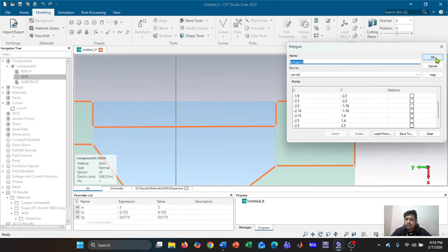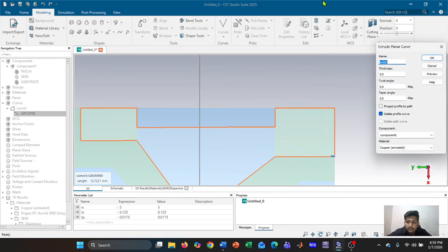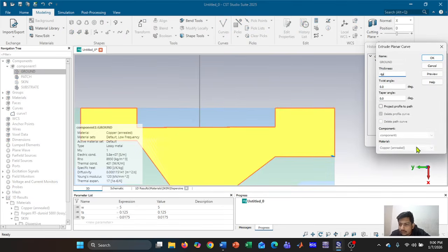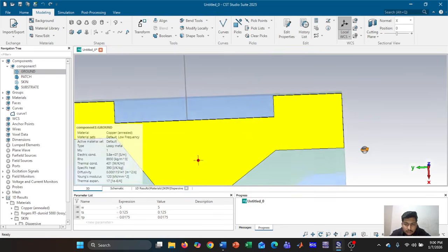Okay, let me name it ground. Okay, double click on it. This one, enter. This one is ground. Okay, the thickness would be minus TP. Preview. Okay, component material is also copper. Okay, yes. Okay, I am done with it.